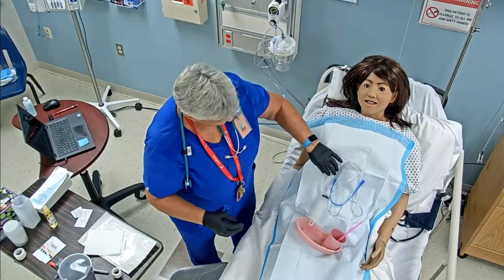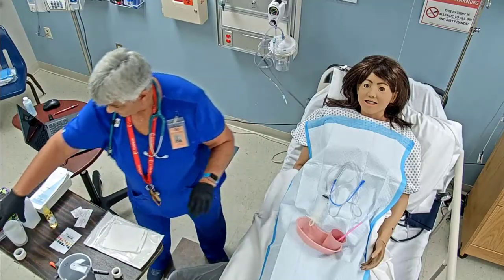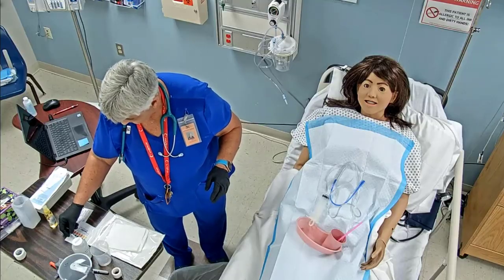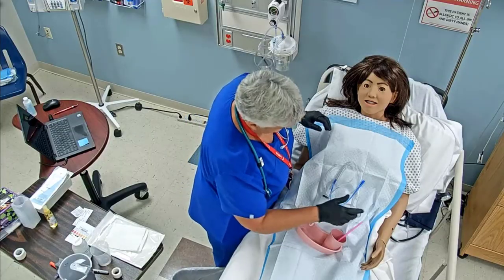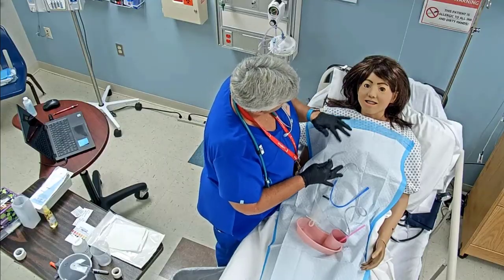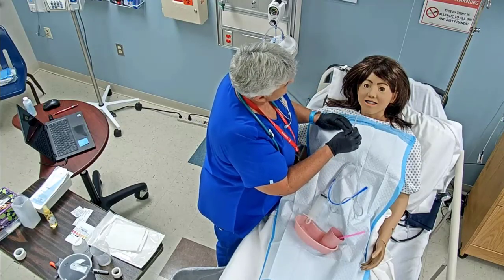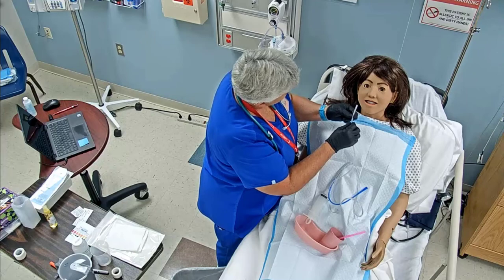Okay, so we're going to start with putting this in. Let me get everything ready here. Okay. To put my device in. Okay, all right, so I think we're ready to go ahead and start putting this in. We've done our assessment, we've checked everything, and so we're going to go ahead and get started. We're lubricated generously. Okay, so what we're going to do is we're going to start and go up and down the floor of the nasal passage.